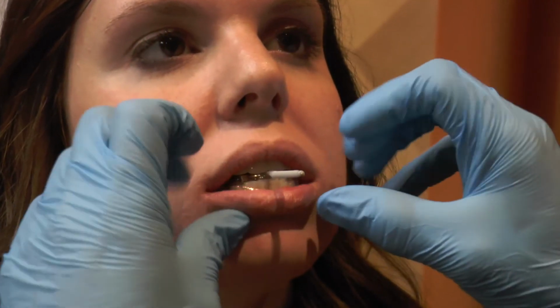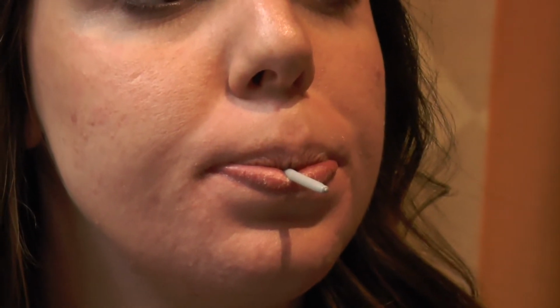And the same thing, you want the patient to pucker up against it and take their tongue and just push up against the tongue side of that lower tray. And we'll do that for about 10-15 seconds. We'll let the tray stay in place. In about a minute, we'll go back in and finger mold the sides to make sure it adapts better to the teeth.